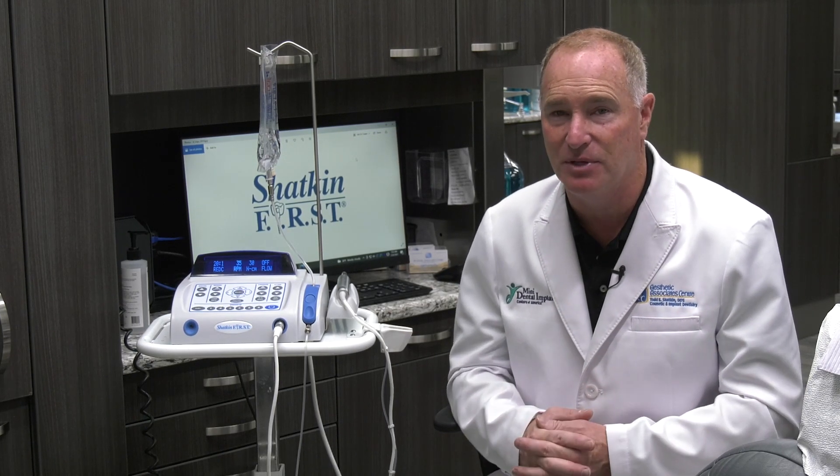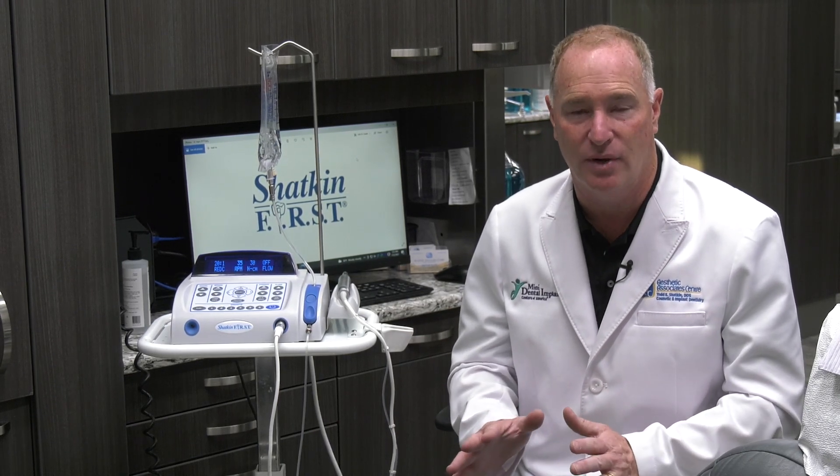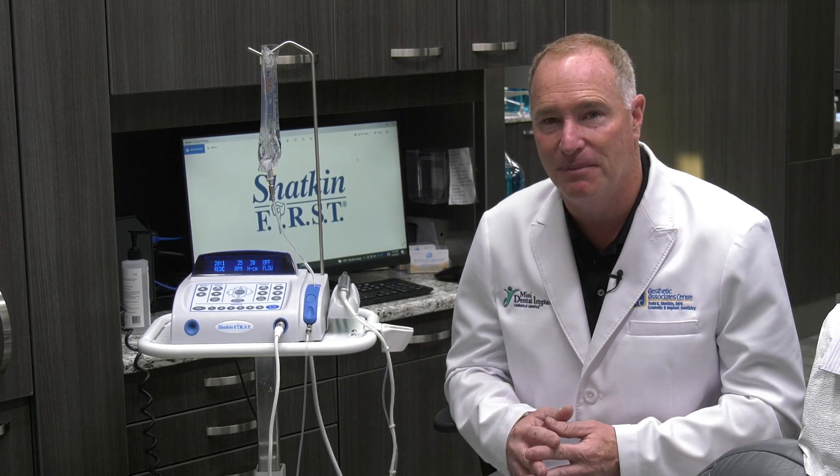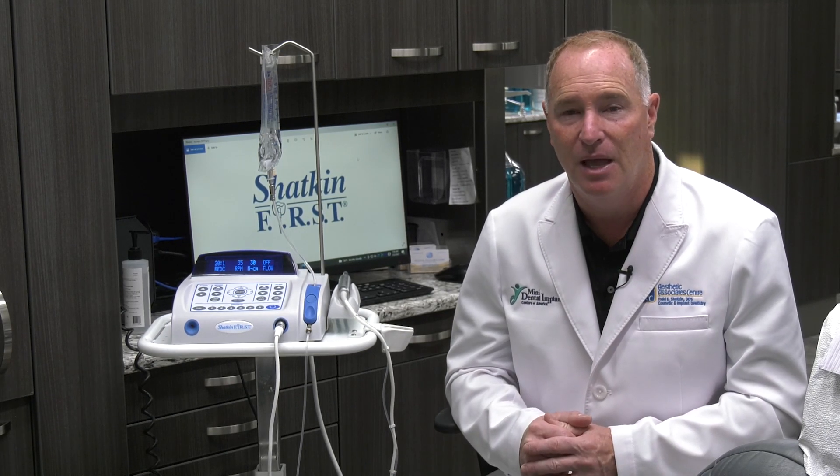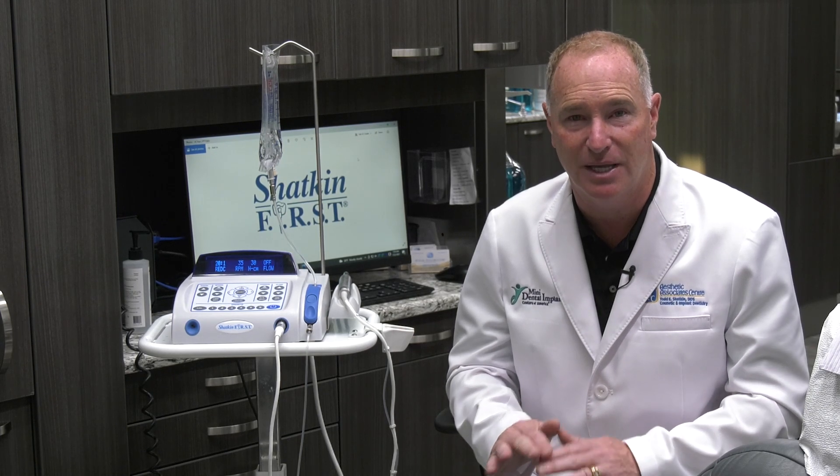The second option is if you feel like the implant is really solid but just didn't quite get to 30, you can leave it without loading it. If it's a crown or bridge, put a temporary healing cap on it, leave it out of occlusion, and don't touch it for about four weeks. You can also splint it to the adjacent teeth with a temporary restoration, but keep it out of occlusion.